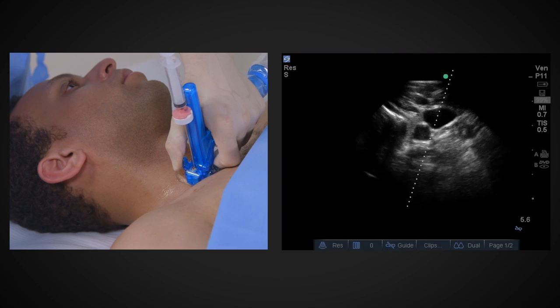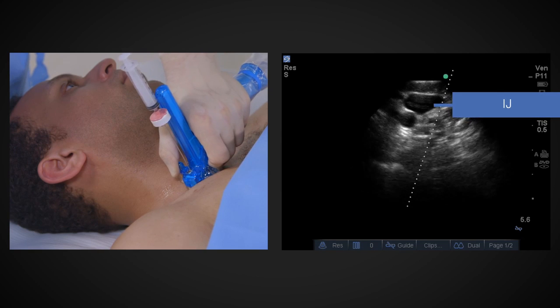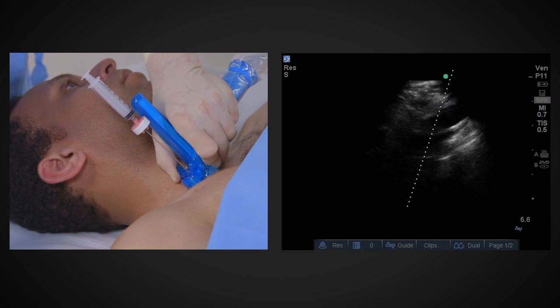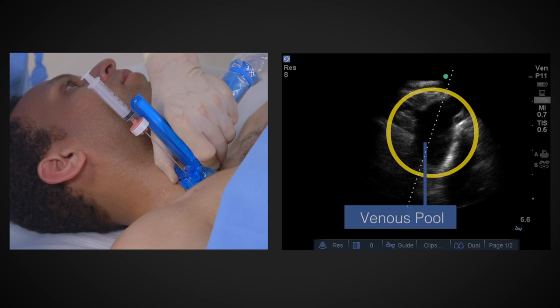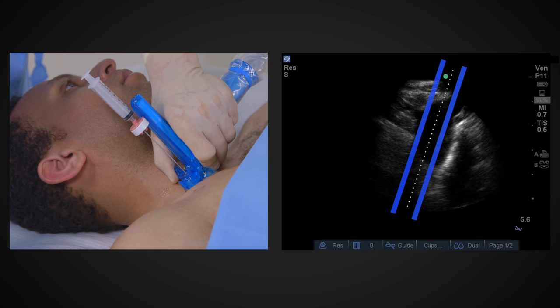In this location, you should see the lower portion of the internal jugular vein. While still maintaining gentle pressure on the needle clamp, rotate the probe into the coronal plane. As you rotate the probe into this plane, point the target line straight into the junction of the internal jugular vein and the subclavian vein. Here, the vessels join to form the innominate vein, or the right brachiocephalic vein — a huge pool of venous fluid that is supported by the surrounding structures and therefore doesn't collapse under the pressure of the needle tip. Furthermore, because of the coaxial alignment of the needle path and the right innominate vein, it's almost impossible to backwall the vessel.